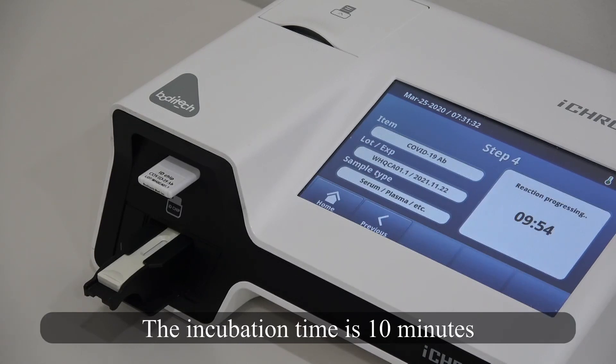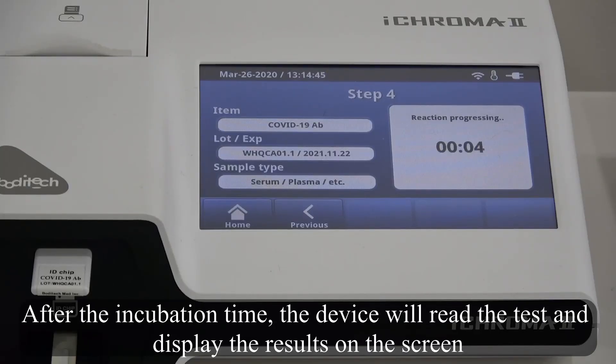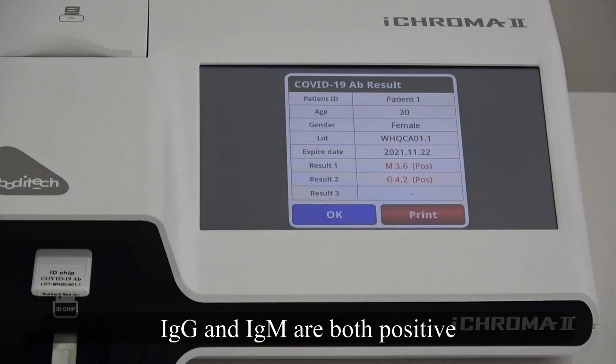Press start to run the test. The incubation time is 10 minutes. After incubation time, the device will read the test and display the result on the screen. IgG and IgM are both positive.